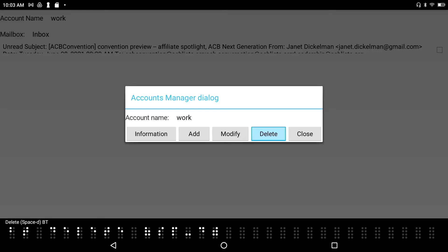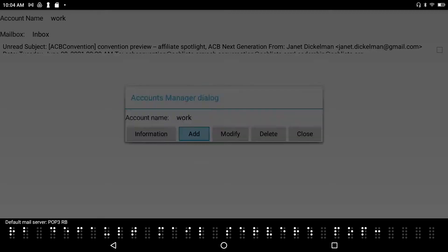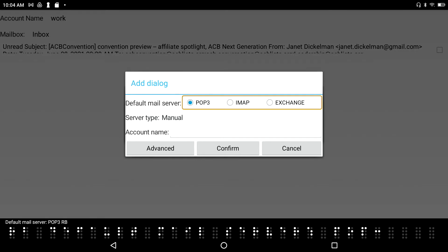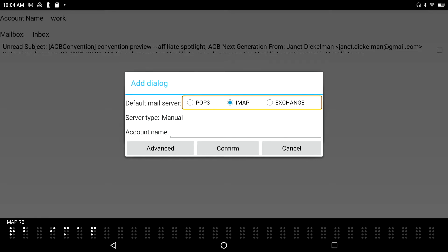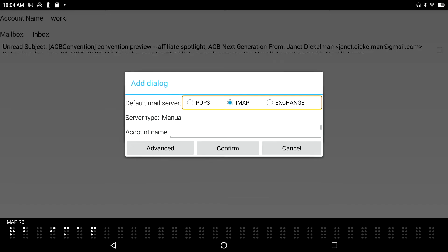I navigate back to the Add button, because I'd like to add my personal Gmail account. I press Enter on Add. The first choice is to pick the default mail server — it starts on POP3. Pressing the space bar cycles between POP3, IMAP, and Exchange. I select IMAP for this Gmail account.